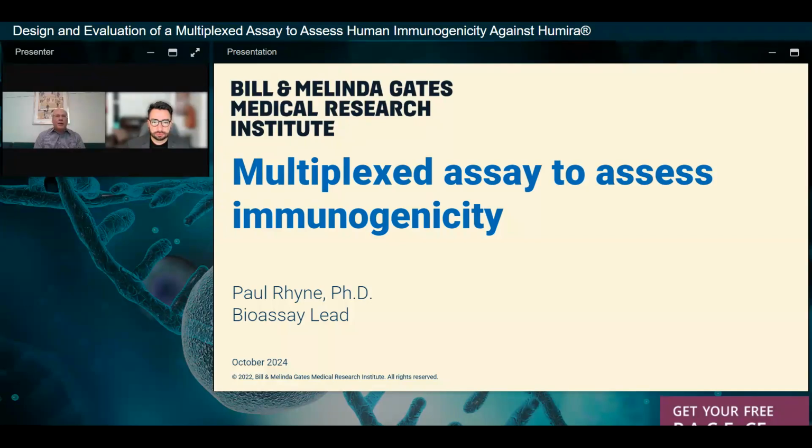One of the ways that the industry gets around that is that you do an acidification of your sample to help break up those complexes first, and then you add your drug conjugates to that acidified mixture. And then when you neutralize the pH, your drug conjugates go back into formation with those anti-drug antibodies.